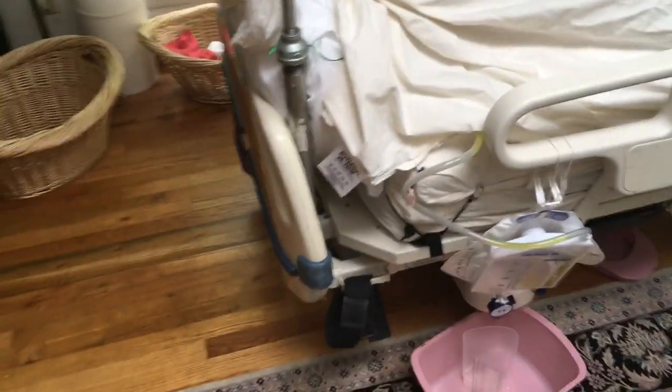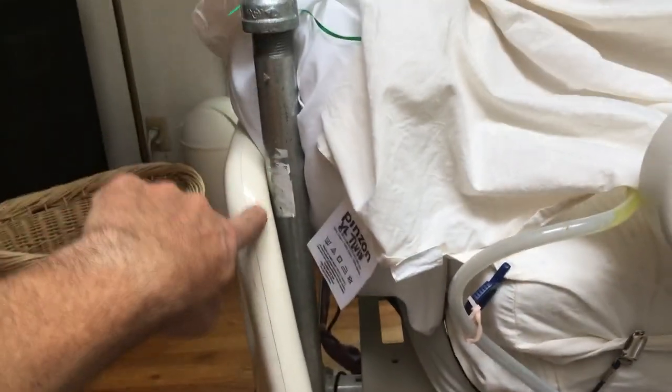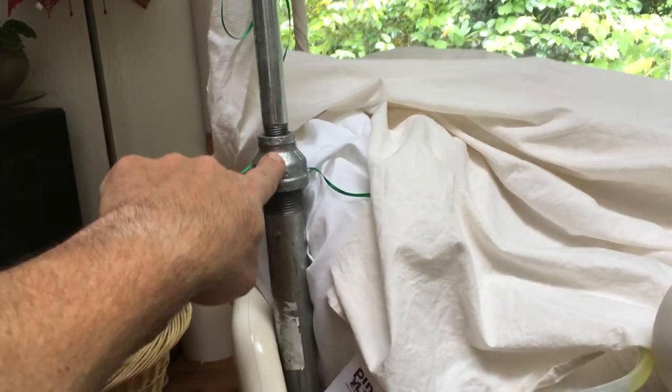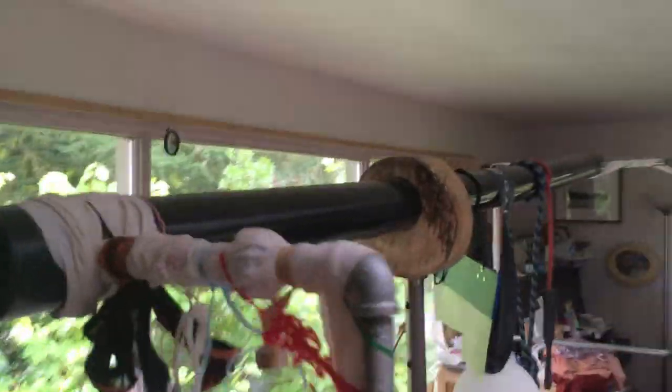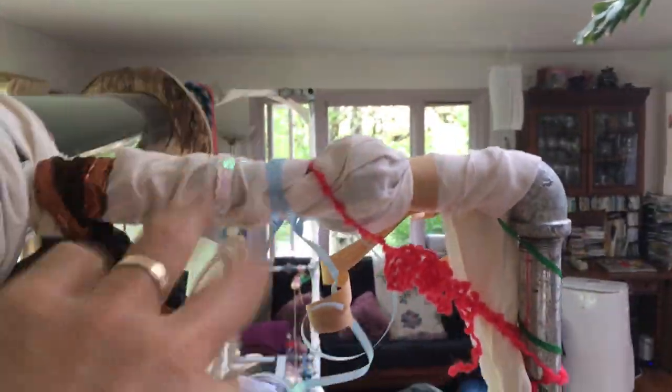The tail of the bed is the same. The only difference at the tail is that we use a longer inch-and-a-quarter pipe to get away from the footboard, so this union happens higher up. Then we go straight to the half-inch. Here we just have one cross piece, and the union is now hidden under a little bit of fabric.